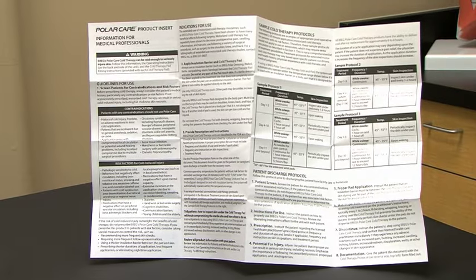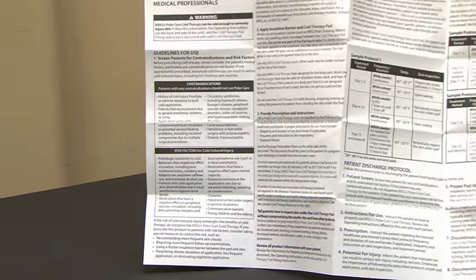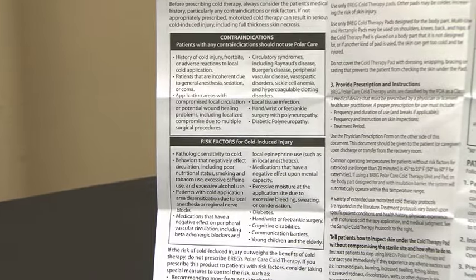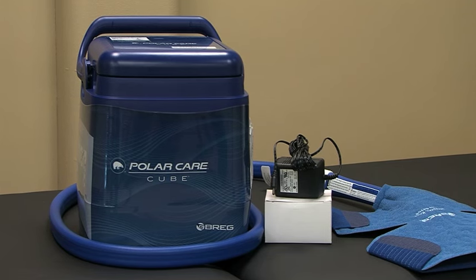Certain medical conditions make cold-induced injury more likely, so before you apply the PolarCare system, it's critical to carefully review and assess your patient with regard to each contraindication and risk factor noted on the product insert.